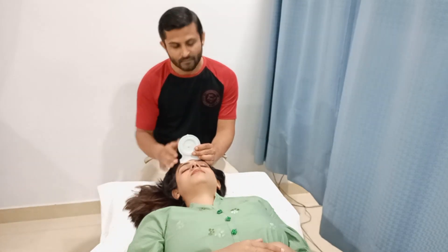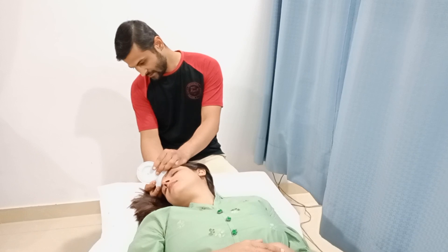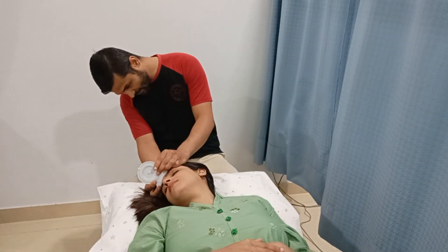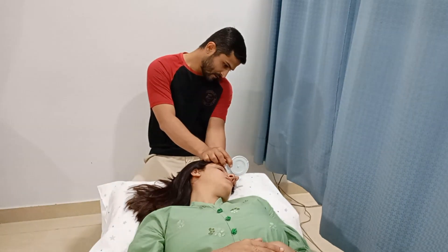We are going to ask the patient to perform the right rotation — it is 60 degrees. On to the opposite side, again 60 degrees.